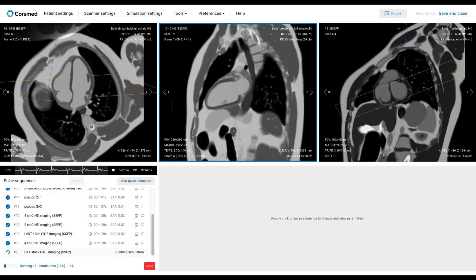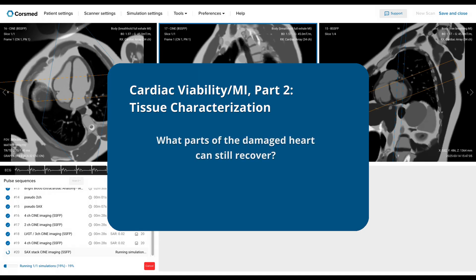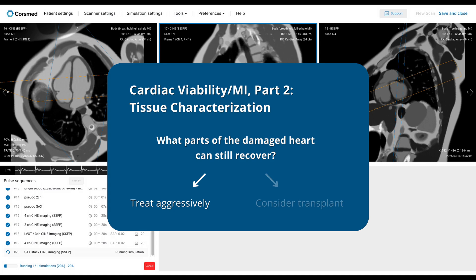Here we are back in the Corsmed simulator with our cardiac viability patient. In part one, we completed all our function and morphology sequences — we saw how to capture the heart's pumping action with our Cine images and how to check for structural abnormalities with our black and bright blood sequences. In this part two, we continue with a core part of a viability assessment: tissue characterization. This is where we answer the key clinical question: what parts of the damaged heart can still recover? This is very important because it determines whether we treat aggressively or consider a transplant.